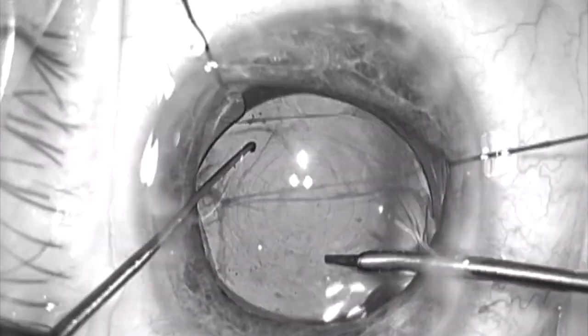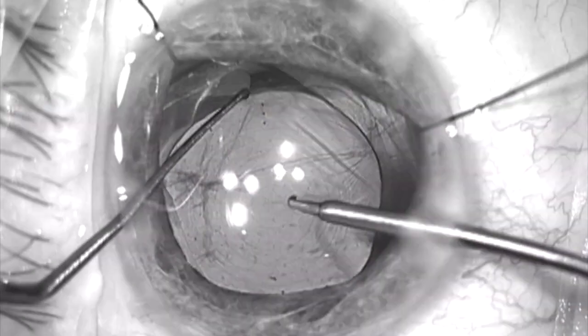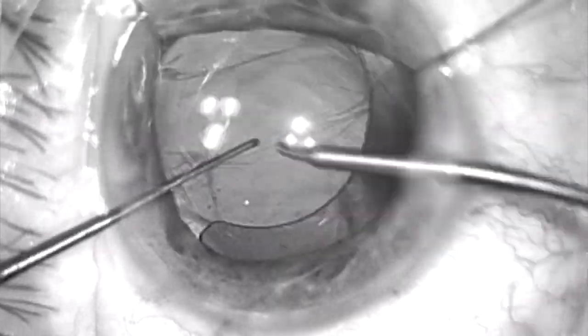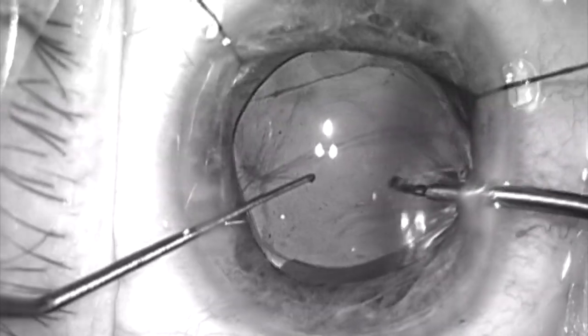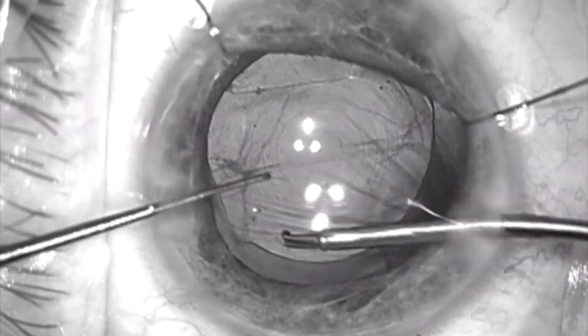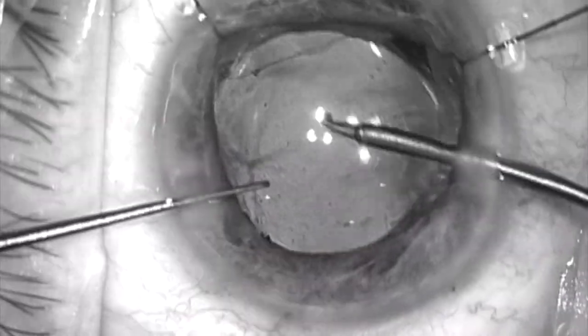And within the equator of the bag, I'm trying to find the best and safest position to leave this lens, where I don't have to worry about that temporal haptic on the bottom of the screen coming up out of the capsular bag — and that there's anterior capsule covering it. So here I'm rotating the lens, and right in about this position I can feel it under the anterior capsule rim and pretty securely positioned. Over here in this position is pretty close to the intended axis, which is about 165 degrees.